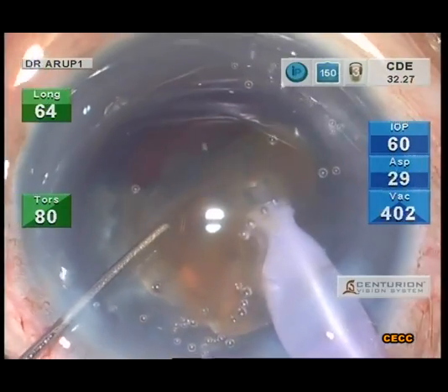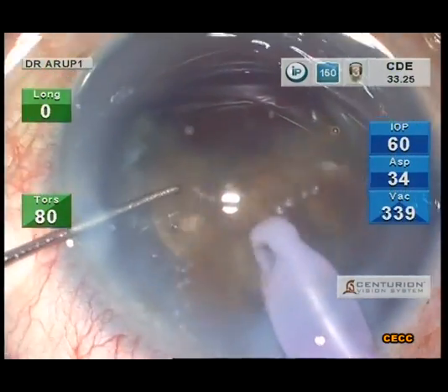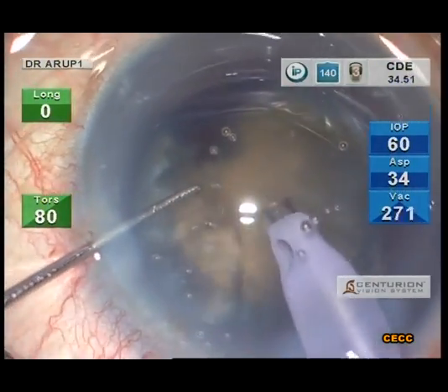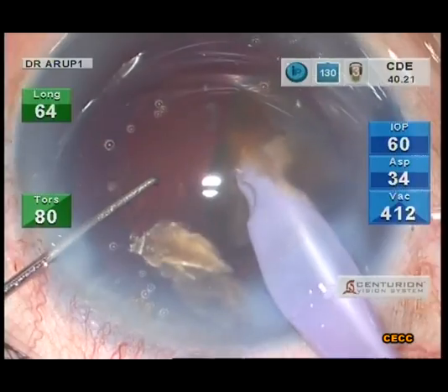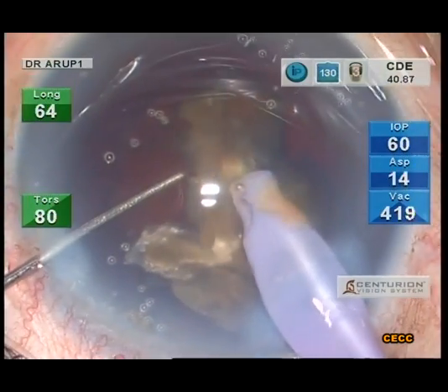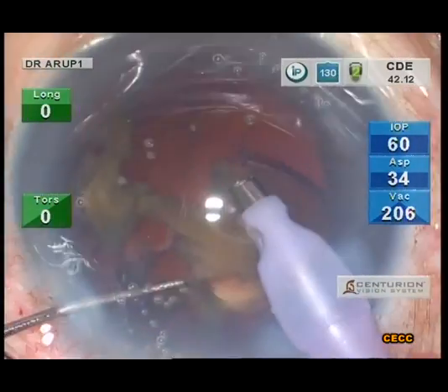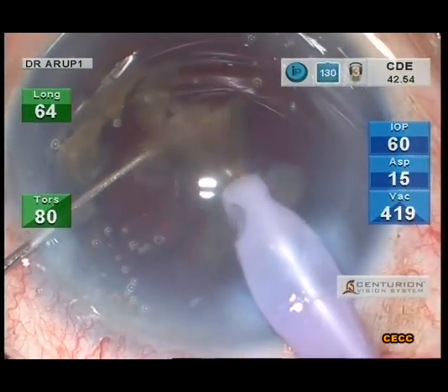One has to guard against post-occlusion surge, though with the higher end machines this is rare. The Sinskey hook in the left hand manipulates the fragment and guides it towards the phaco tip. Frequent dispersive OVD replenishment will keep the cornea clearer on the first post-operative day.